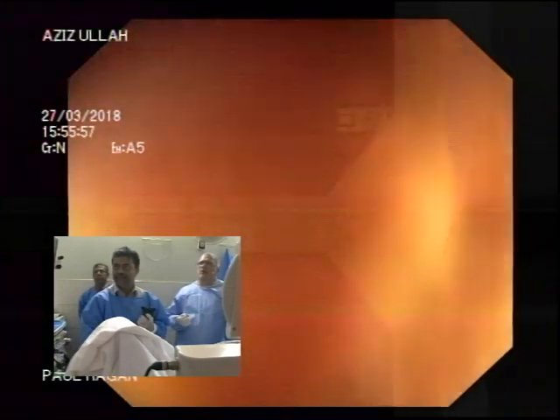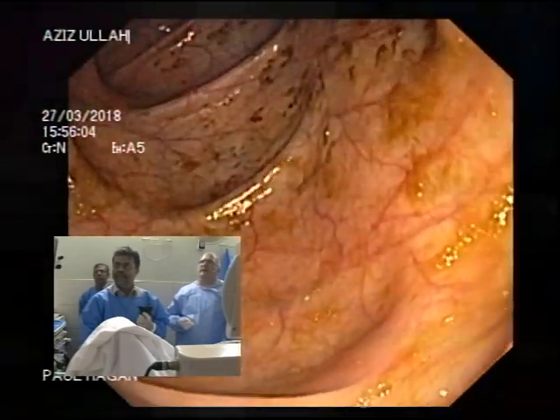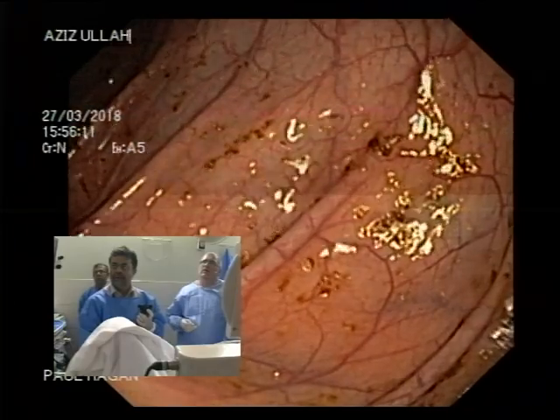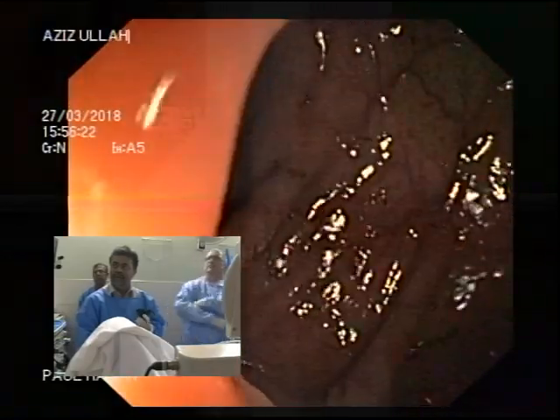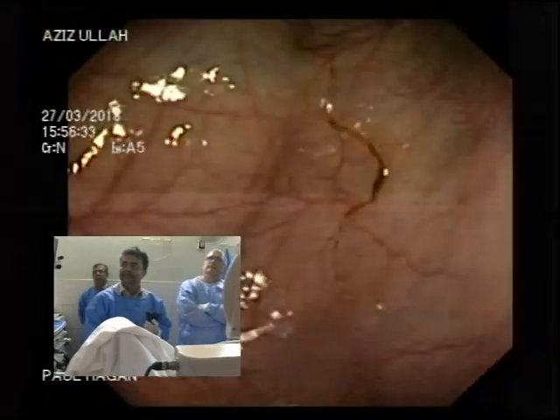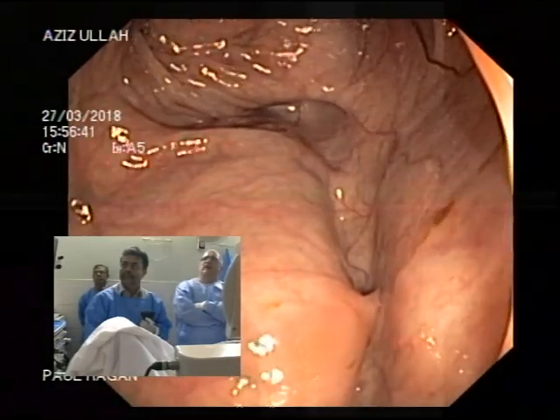Okay. Brilliant. Now you can see where you want to go, or have an idea where you want to go. So if you come back a little bit further. Good. Great. Well done. Suck. Suck. Stop. Now draw back the scope. Slowly. Now go forward. Good. Excellent. So, how's the patient? Yes, I am. Okay. Good man. Well done.